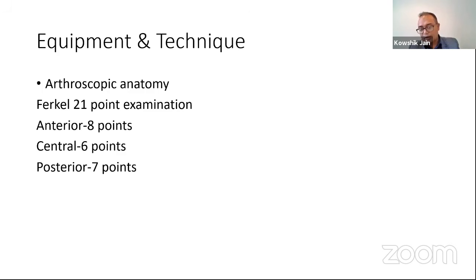Put an artery clip and enter the ankle joint, and then you can put a probe or your shavers or your burrs through the anterolateral portal. Just one word of caution: every single time you do anterior ankle arthroscopy, please exchange portals. So when you start off with anteromedial portal, you put your scope in.